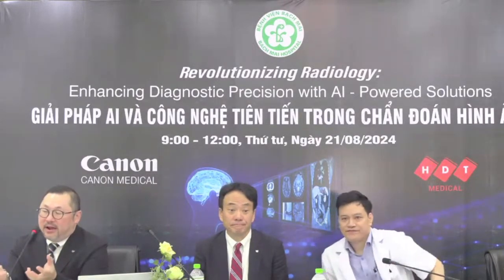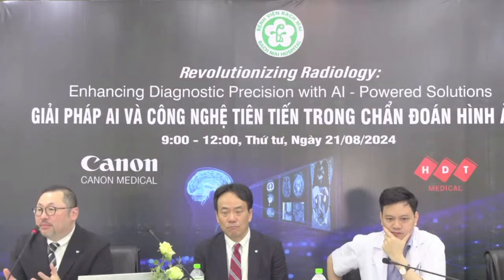For Canon AI, especially in the modalities like CT, ultrasound, MR, and even the angio, we use the data from Canon to train. So this is optimized for Canon data, and that's why it's only applicable for Canon data.